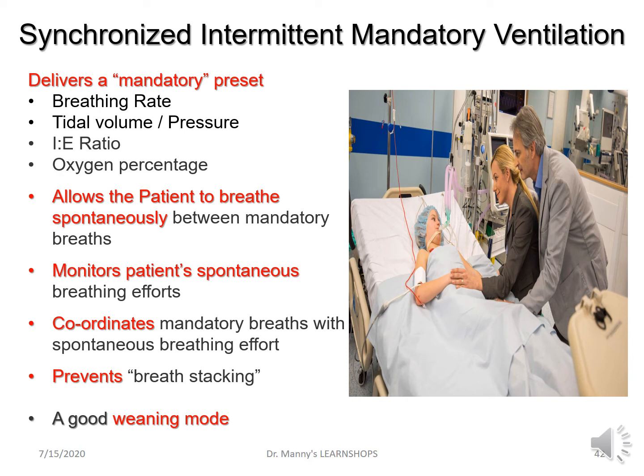It also monitors the patient's spontaneous breathing efforts, and when a mandatory breath is due, the ventilator will coordinate the mandatory breath with the spontaneous breathing effort. And this is good because it promotes compliance with the patient and the ventilator. And it prevents what is called breath stacking, which means here the ventilator and the spontaneous breath are combined. Because if they're combined, this may result in fighting the ventilator.